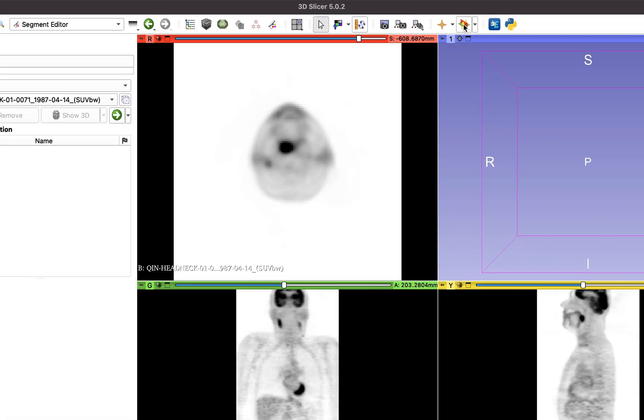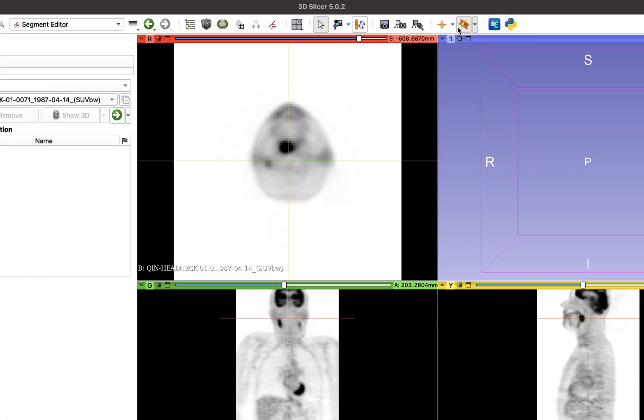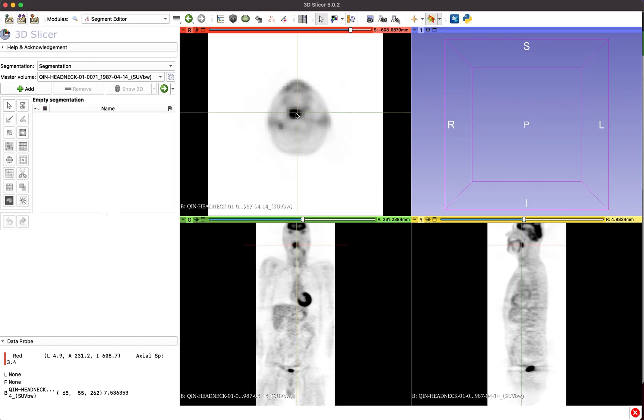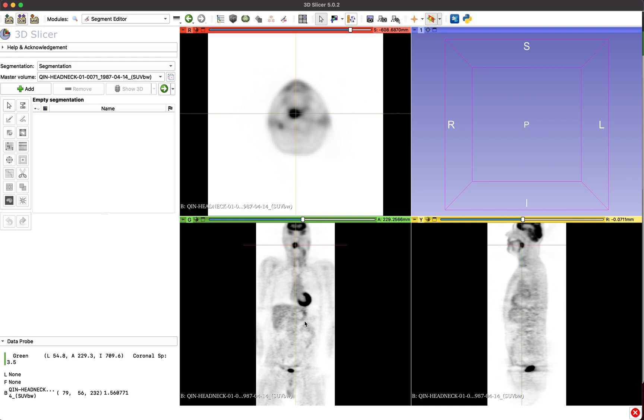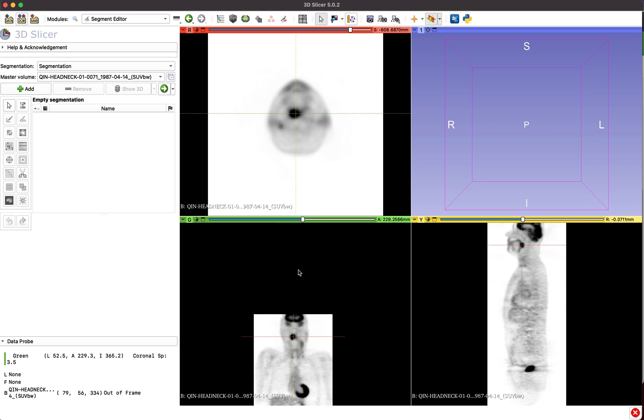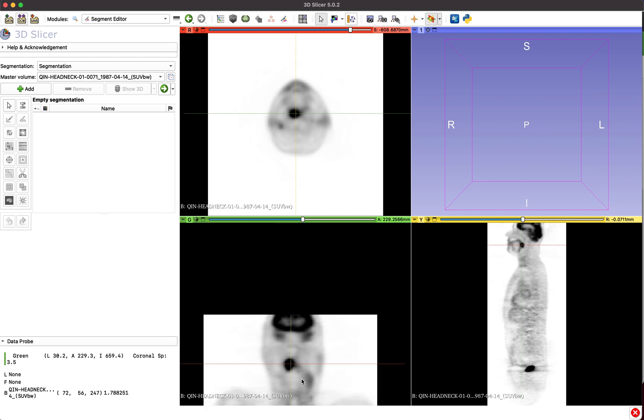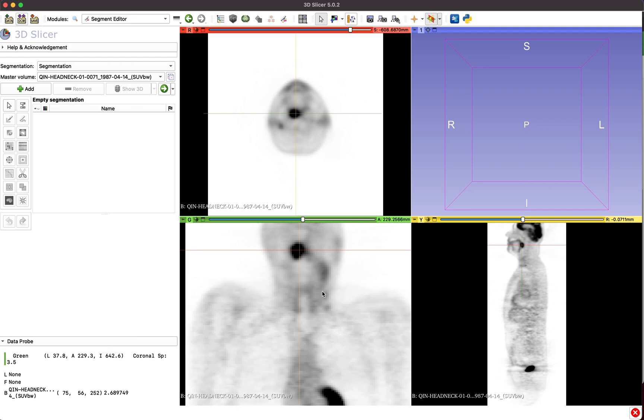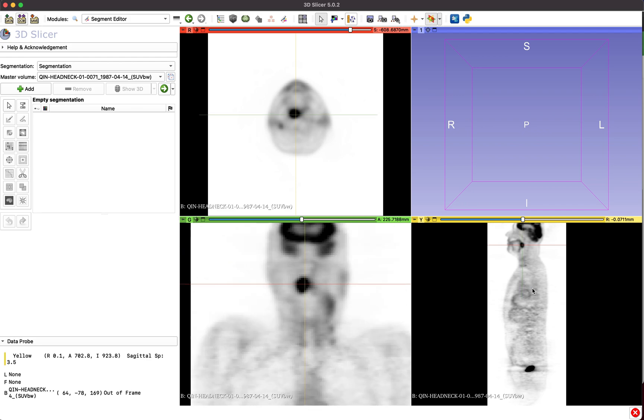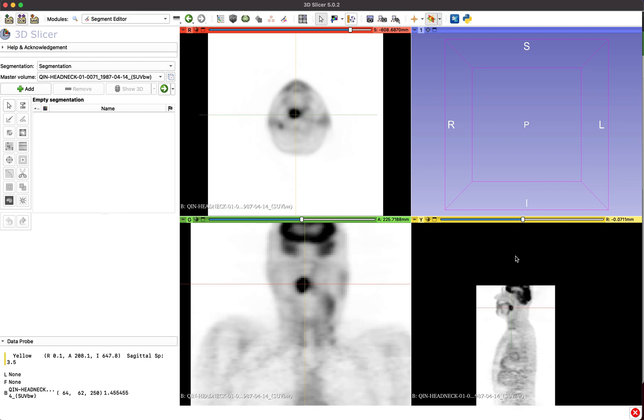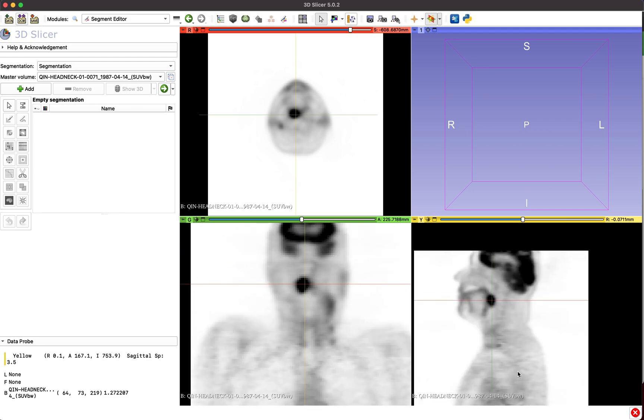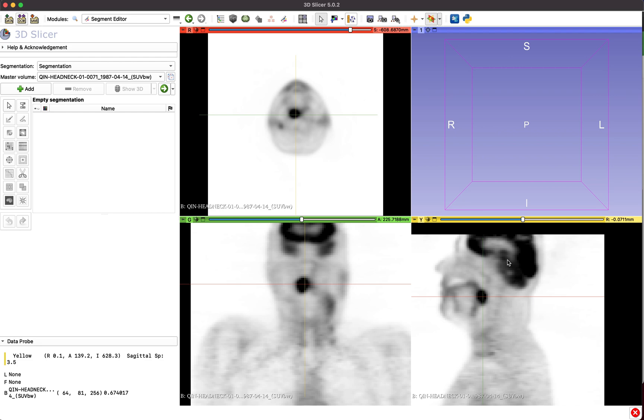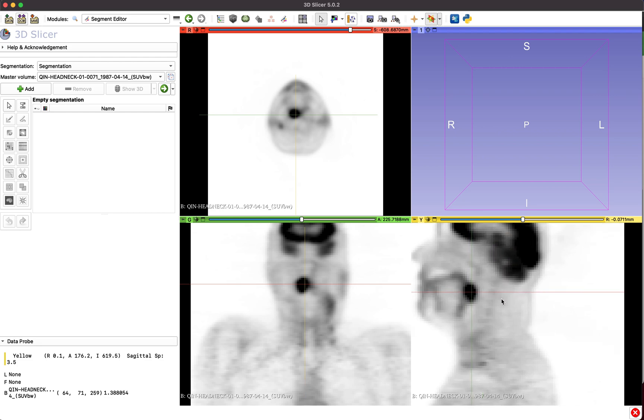Enabling slice plane intersections and holding the SHIFT key down while moving the mouse cursor over a high uptake region in one slice automatically shows the same location in both other views. This makes it easier to get an impression of the lesion in 3D and locate a rough lesion center.